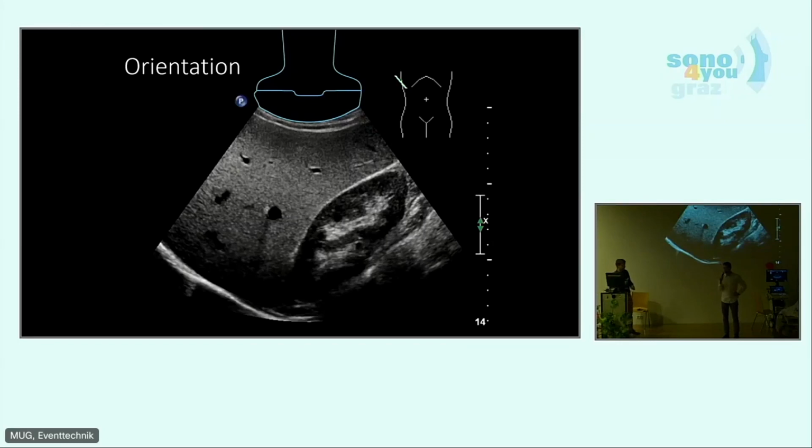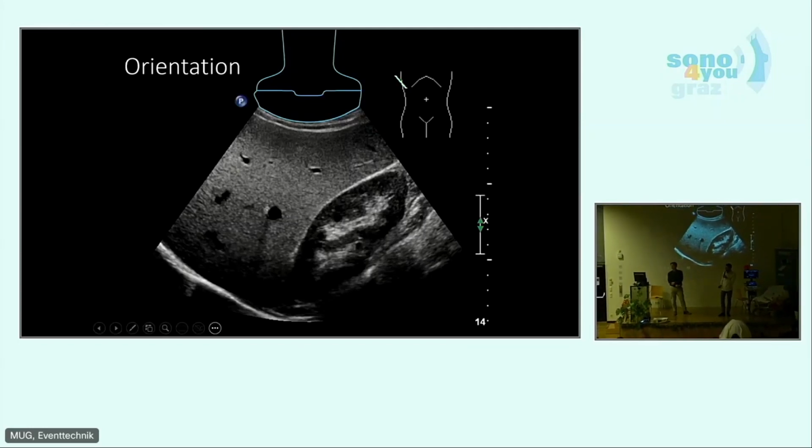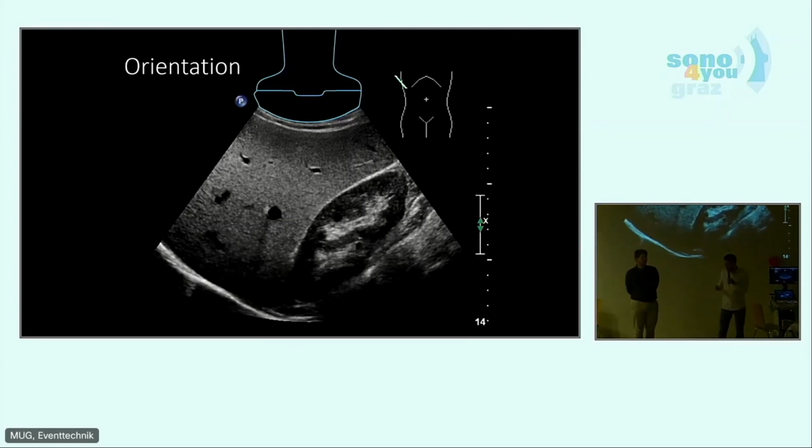It's about the orientation. It's extremely important to talk about that because it can get confusing, and this is for your first hands-on session. With every image, the first thing you do is orient yourself. It's easy to figure out what is close to the probe and what is far away from the probe. Depending on the probe's position, this could be lateral and medial, or anterior or posterior. But when you come to the sides of the image, it can be a little bit complicated. Is it up or down, or right or left?